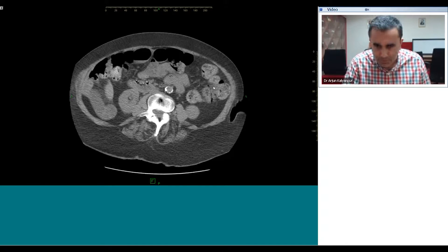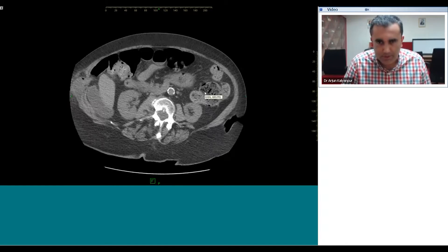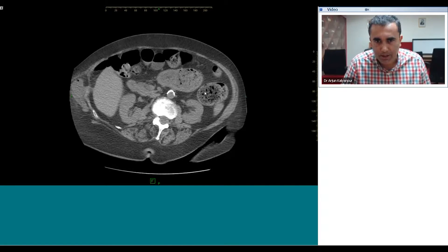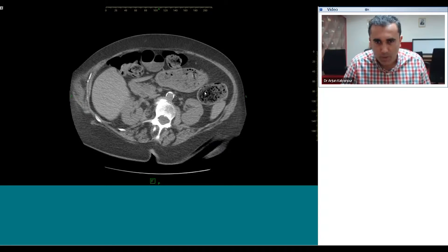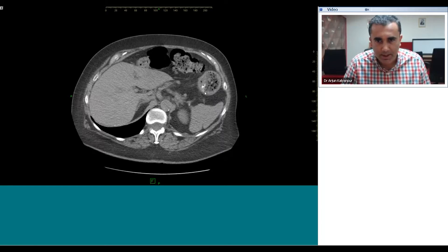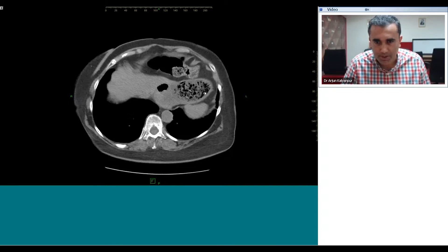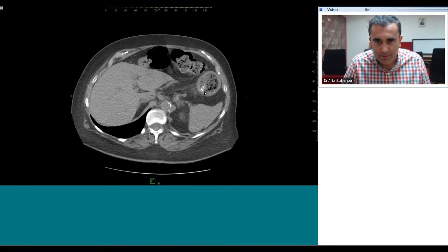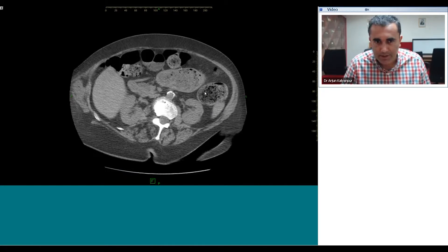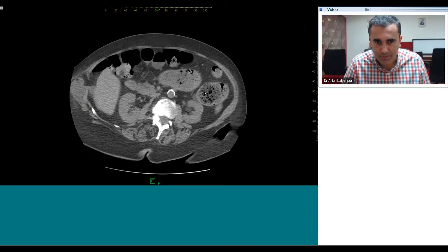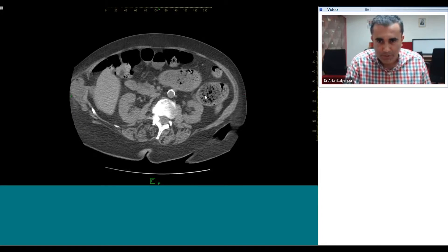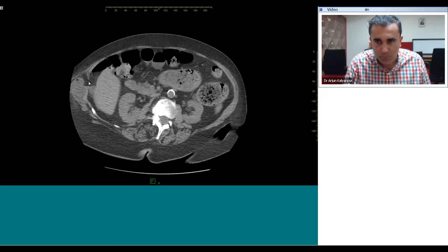The next job at hand is to identify where the obstruction is taking place and what is causing it. As we scroll through, there is a finding that is not immediately apparent at first review, but if we spend a moment in this section we see that there is a small defect in the lateral abdominal wall and that a segment of the small bowel has herniated through.